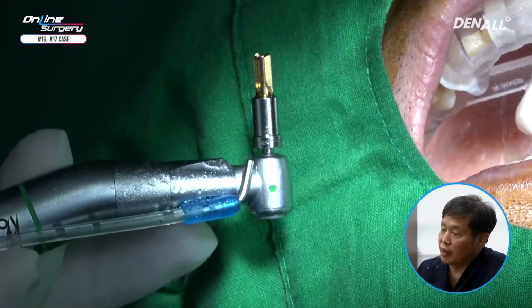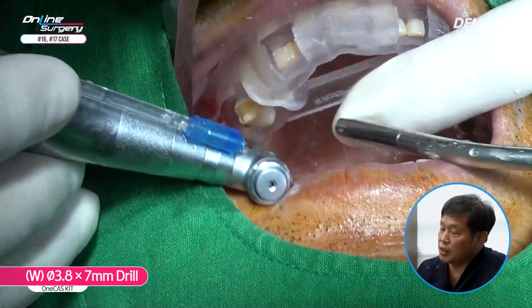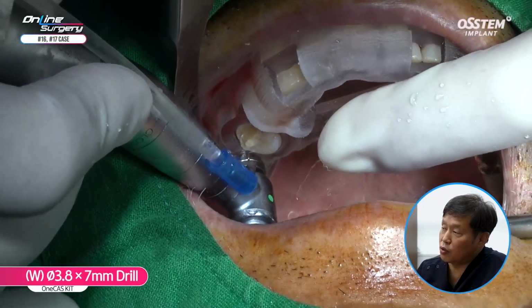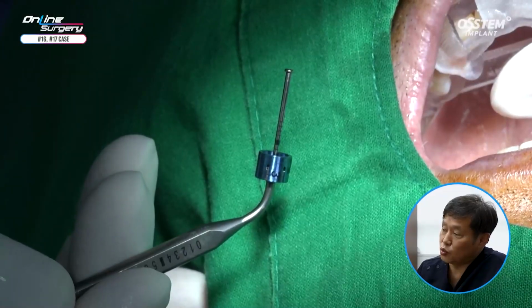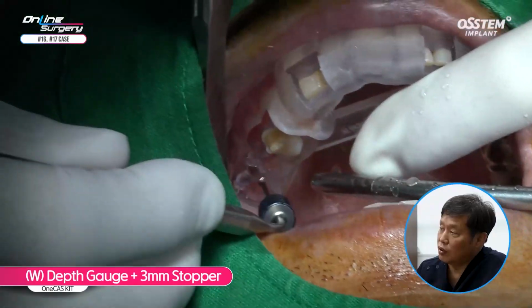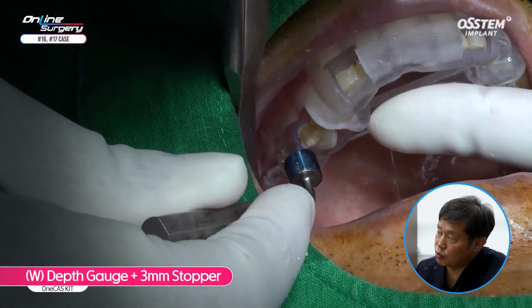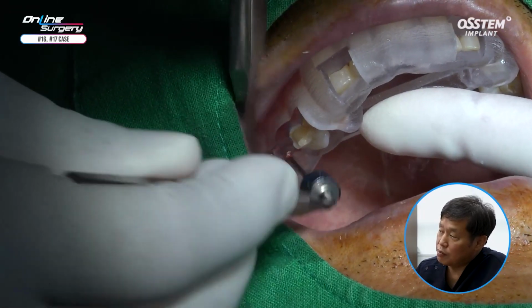Next is 3.8 by 7 millimeter without stopper. Drilling is done up to 7 millimeters. In the case of OneCAS, the drill hole is expanded, and while using the final drill, you need to progress. It has been drilled up to 7 millimeters, so a 3 millimeter stopper is used on the depth gauge. You can see there is contact. Sinus floor is penetrated.